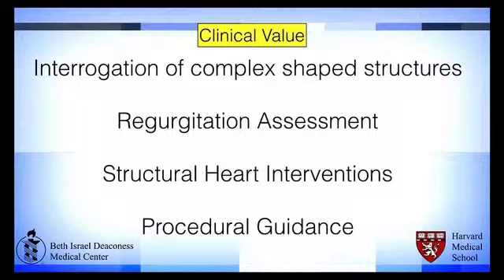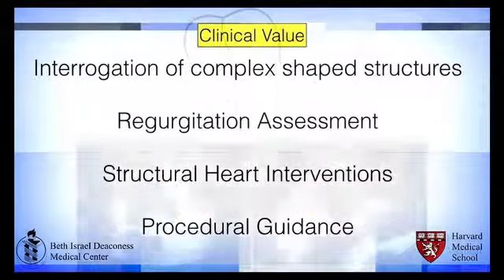Most of our cardiology colleagues are not used to looking at three-dimensional images the way we generate them on the screen; to them, the orthogonal plane image makes more sense. So it is actually more useful for them and helps them more in guiding their catheters and other devices in the septum and on the valves if they are able to see them in two orthogonal views.